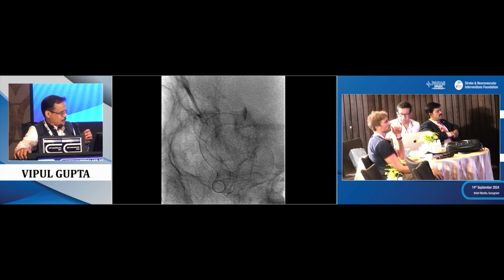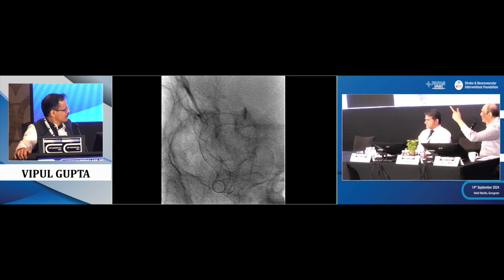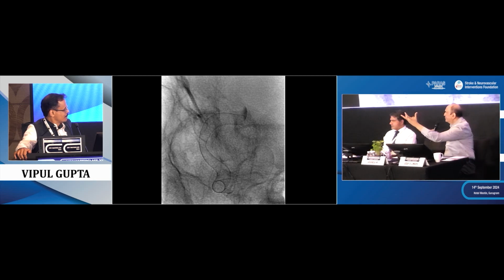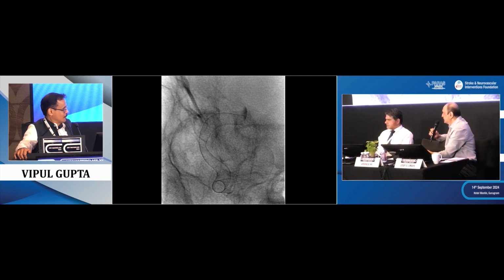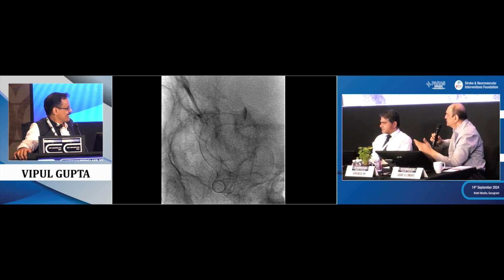So Uday, we were discussing in this slice course this kind of distortion of the stent, and I practically destroyed the end of the stent a bit, truthfully. Should we have deployed a Solitaire or any other stent there? That's the thing you can do. This is such a long stent, and it's reasonably well opposed. You have had a small problem, distal embolus. You don't want to pull the entire construct out. No, I didn't want to pull it out, for sure. So that's the only other thing that you can do. You watch it for half an hour, go out and come back, or maybe repeat an angiogram and see if everything is okay. I will leave it.